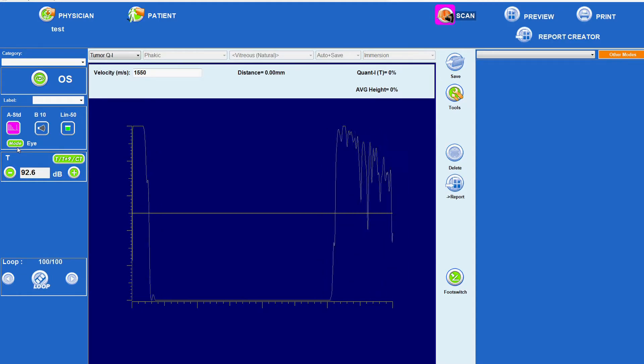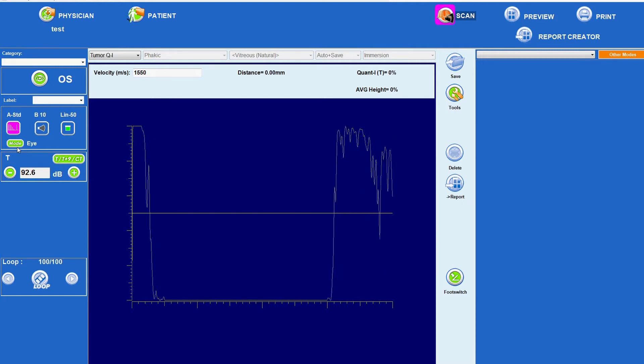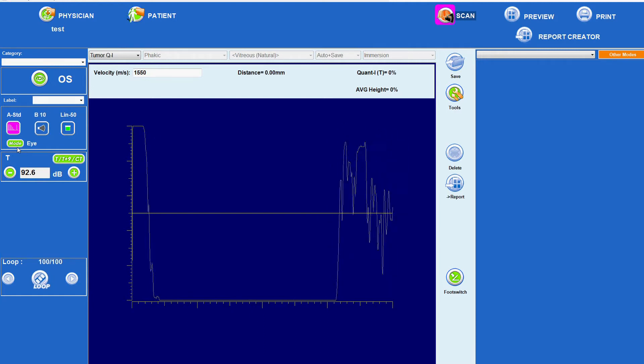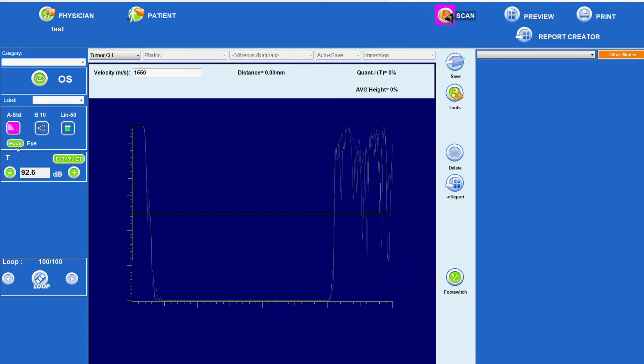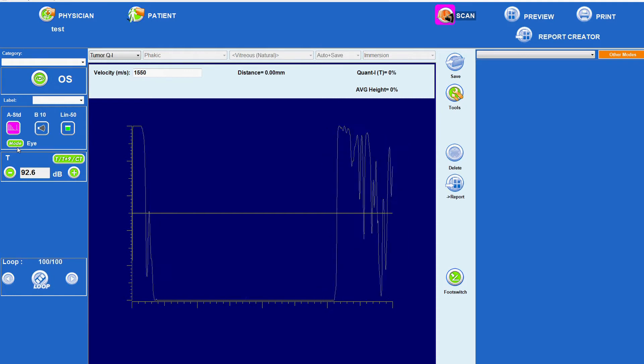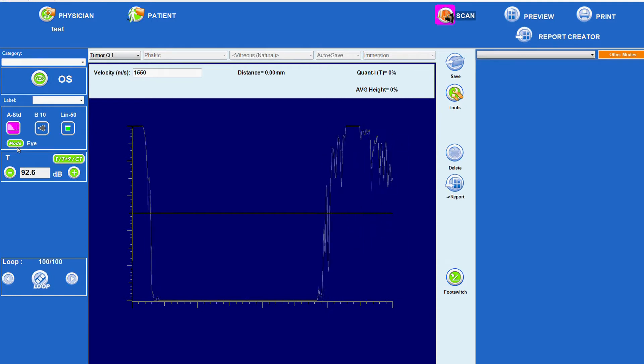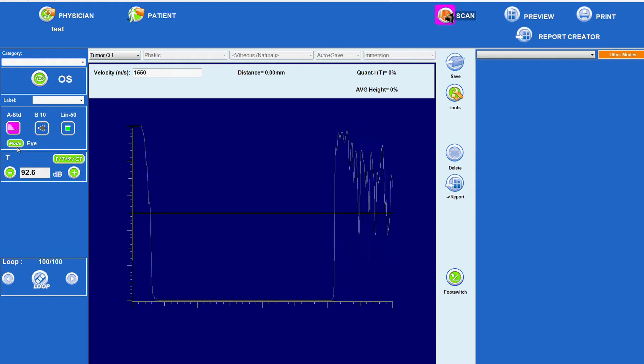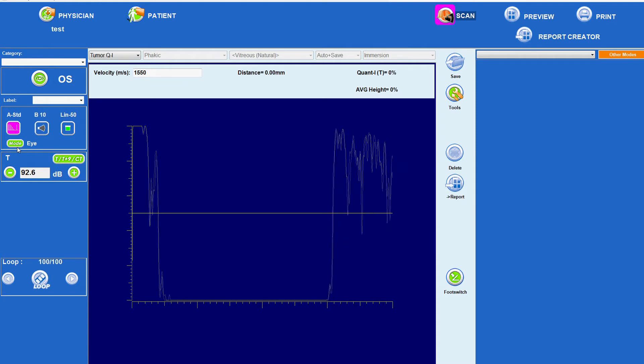When the sound waves encounter a surface, the amplitude of each echo or reflection returned back to the probe is displayed as a vertical spike along a baseline. The height of the spike or echo is directly related to the density of the tissue encountered by the sound beam.